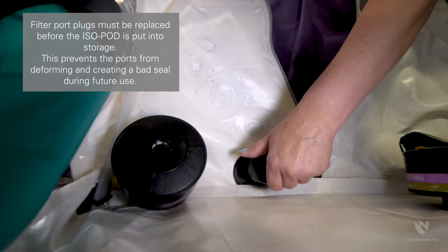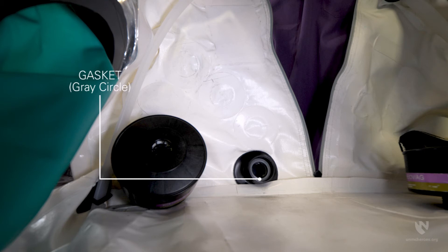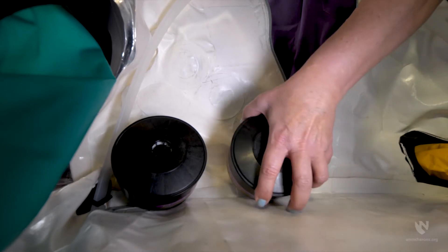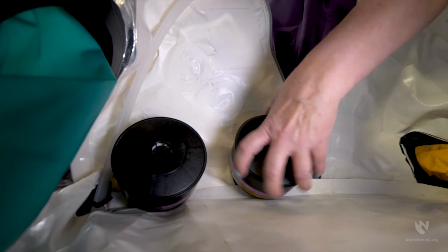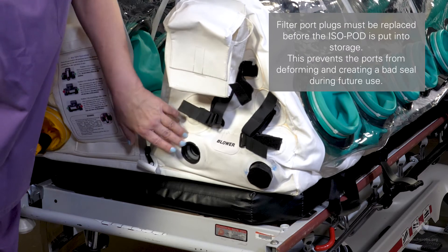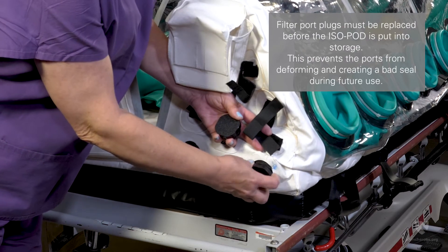At the foot end of the enclosure, remove filter port plugs from the interior ports. Recheck each port for the gasket before installing the filter. Then install both HEPA OVAG filters, being careful to not over-tighten the filter. Remove the exterior filter port plugs at the foot end of the enclosure and ensure each port has a gasket.